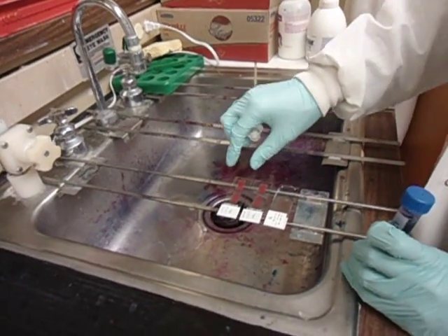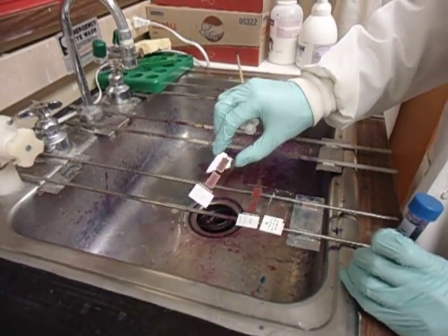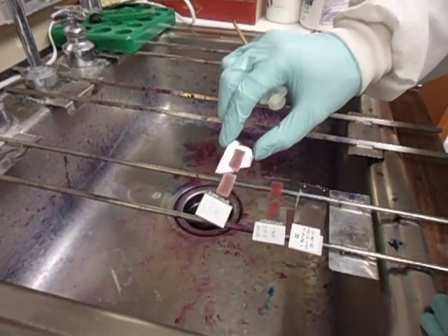We'll be staining at the same time. Here are the slides that we made before — they've already been dried for 15 minutes.